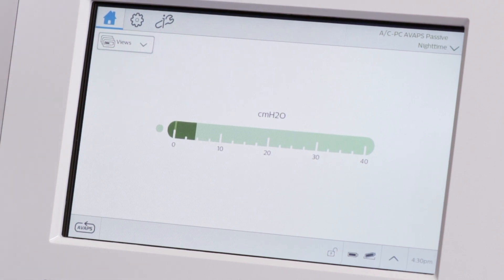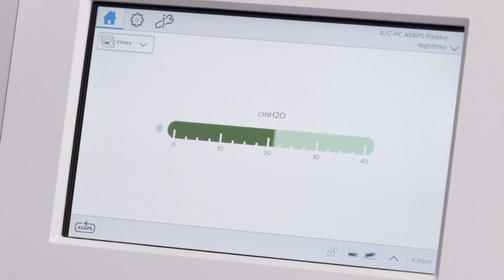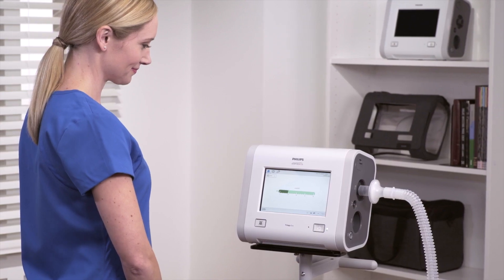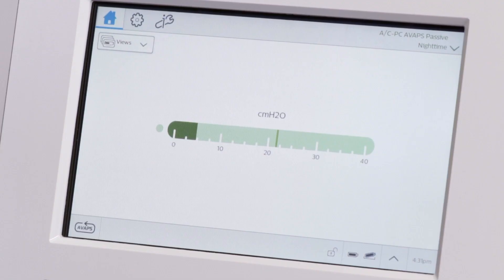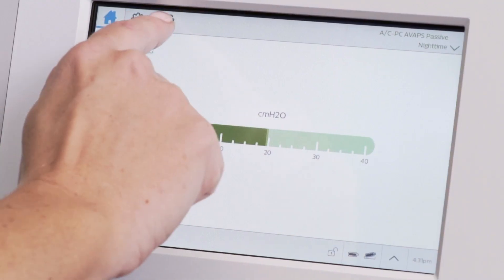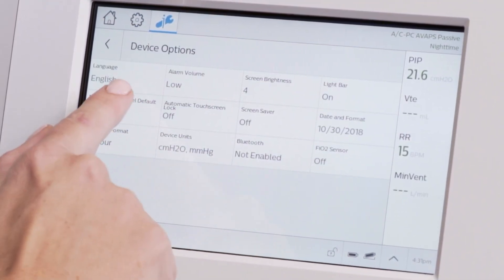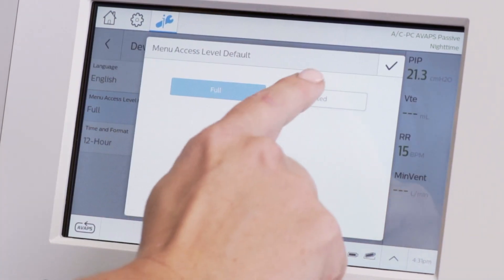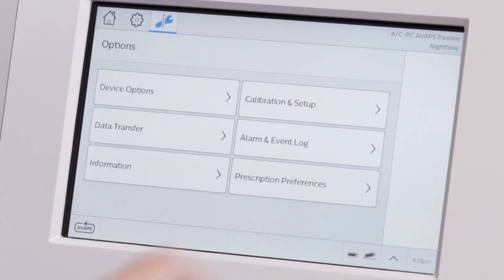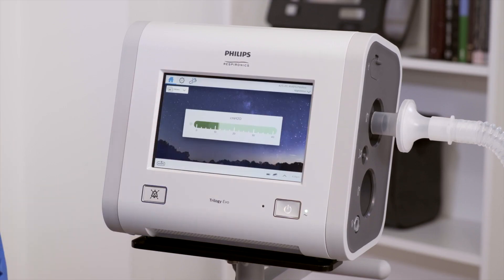As you can see, we are now ventilating with the nighttime prescription. In order to see the customized window background, change the device to limited access by selecting Options, Device Options, and then Menu Access Level. Now select Limited and tap the checkmark, then return to the home window.